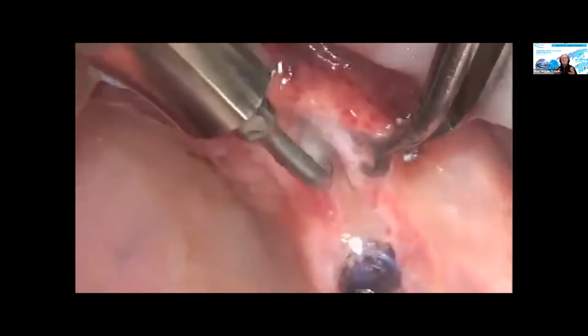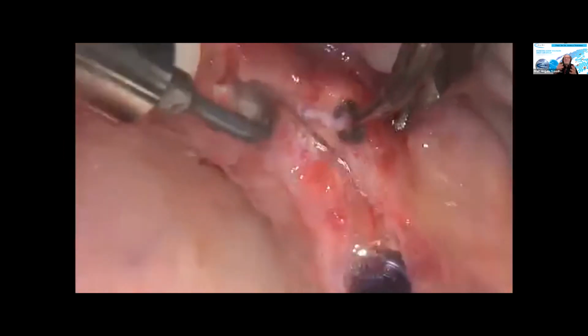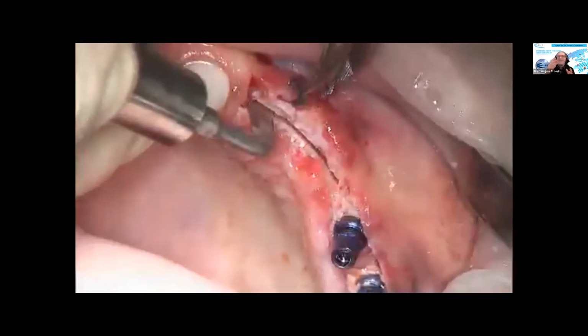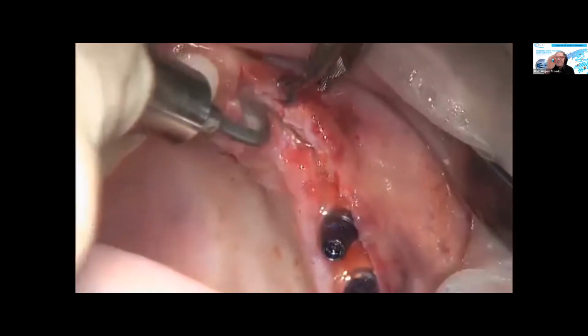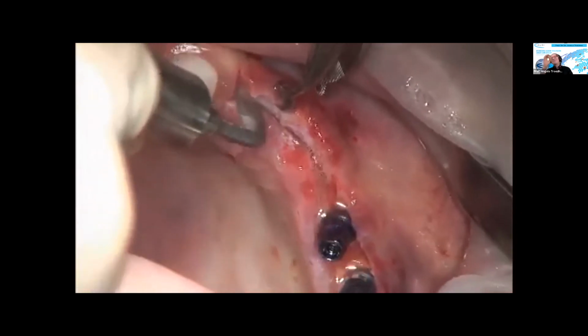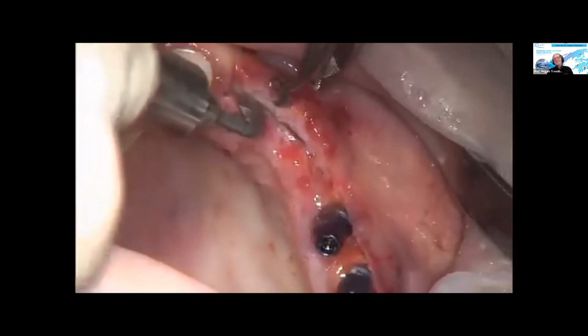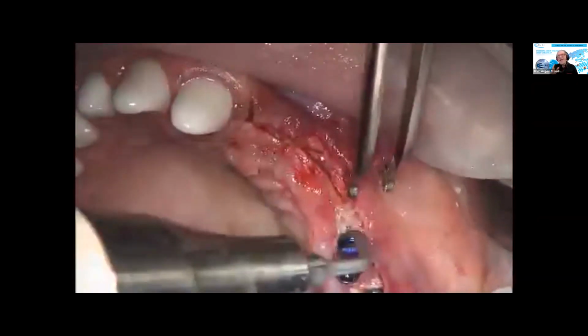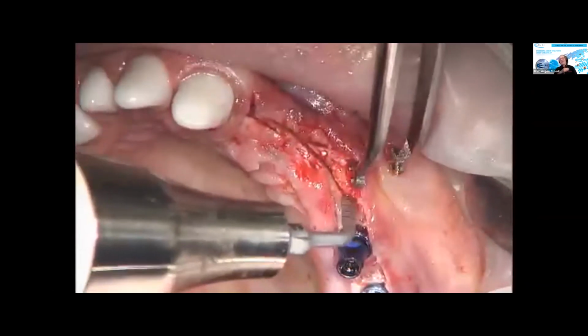Contrary, with rotary instruments, you're under constant stress. So with rotary instruments, 5 minutes of work seem to be 30 seconds. And 30 seconds of working with piezotome instruments seems to you to have taken 5 minutes. That's the difference, because you can be relaxed and you don't have to fear intrasurgical iatrogenic complications.